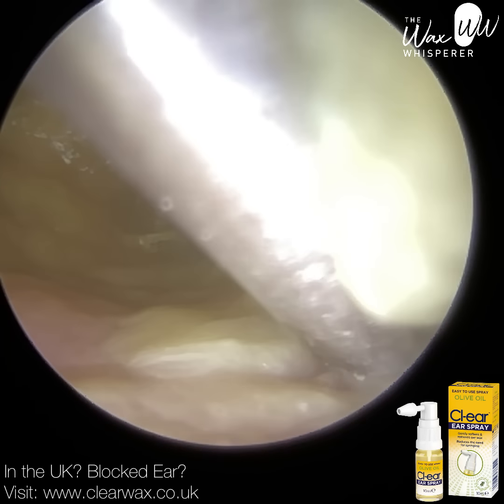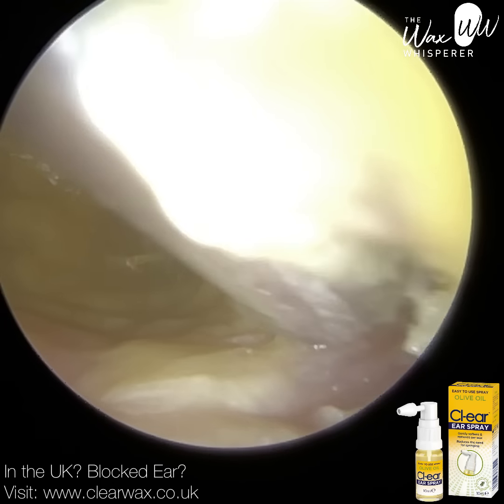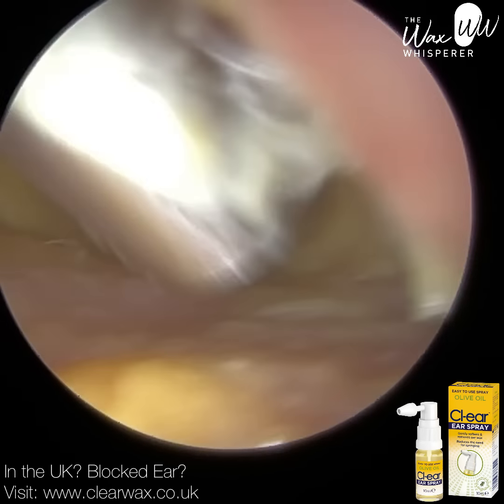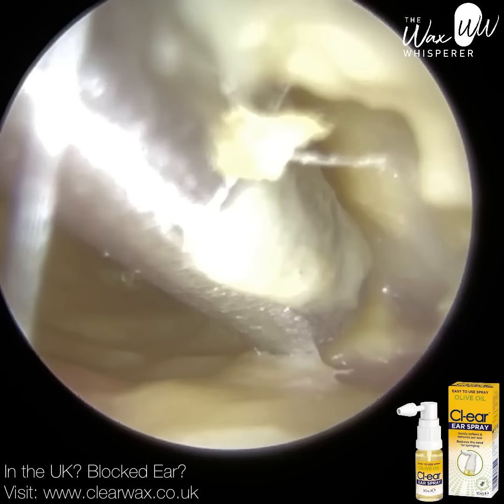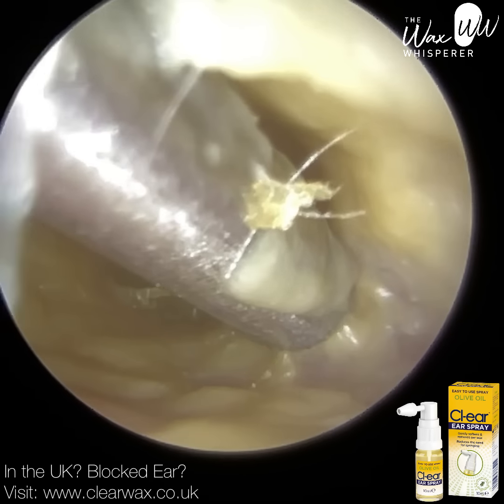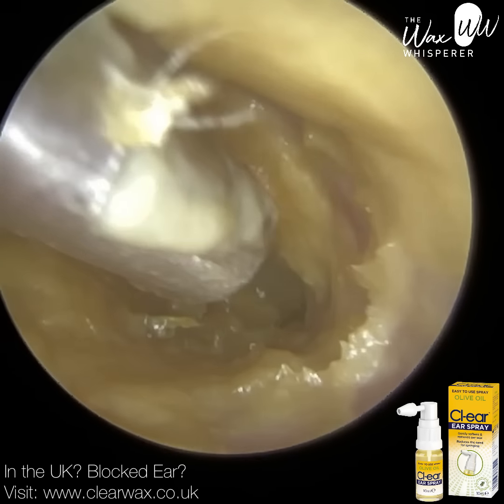Even at this very early stage of the procedure, the patient could hear it significantly better, because you may have seen that when I was using the suction probe a moment or so ago, I created an opening whereby the eardrum is now visible, and that instantly relieves the pressure for the patient and it allows some sound to trickle through towards the eardrum. So we're just probably the midsection of the ear canal now, and I'm just hovering over.